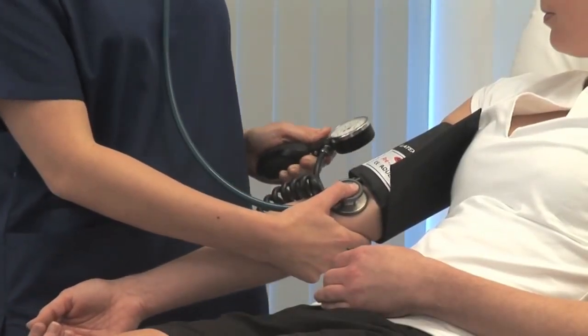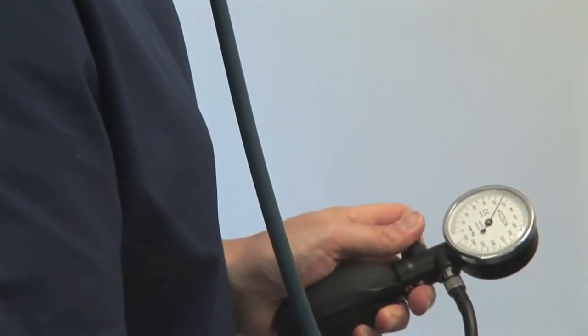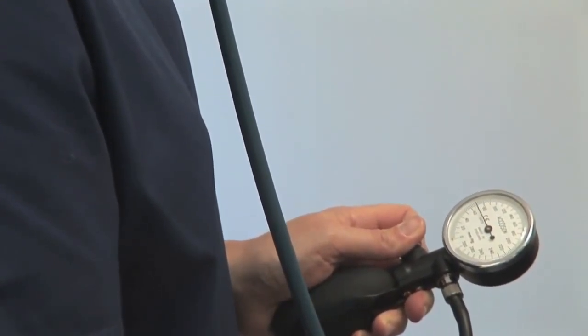Slowly deflate the cuff by 2-3 mmHg per second. Note the pressure at which the regular tapping Korotkoff sounds appear. This is the systolic pressure.